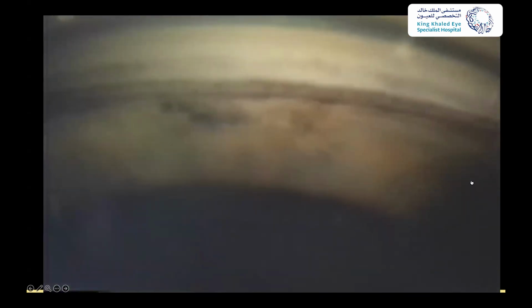I like this video. This is somebody who, you look and you think, well, that's trabecular meshwork, that's scleral spur, so I'm going to do my laser. I'm going to come kind of blast along here. But when I indent this eye, what I realized is that that actually was not the trabecular meshwork. That was a Sampaolesi line right there. Meshwork is way back here, and that's scleral spur.